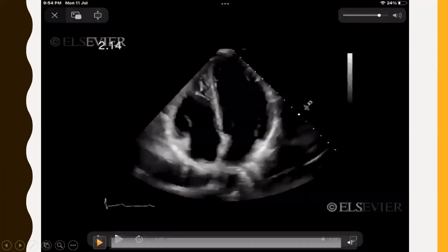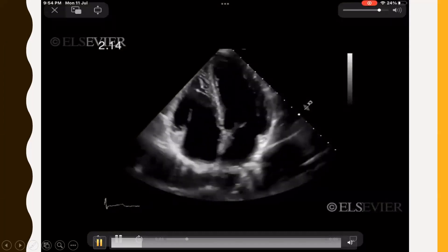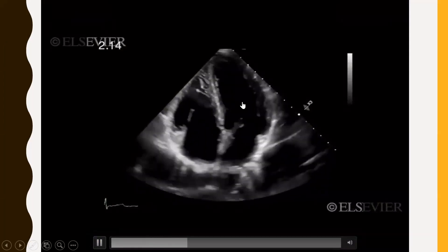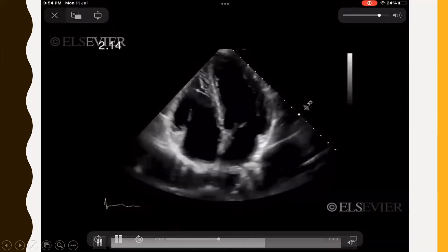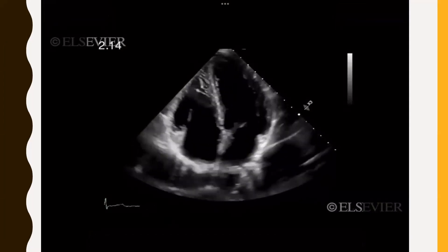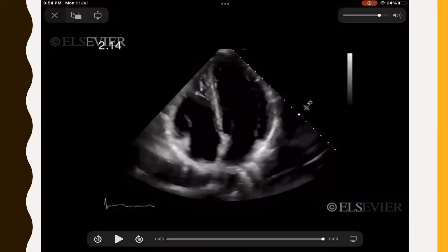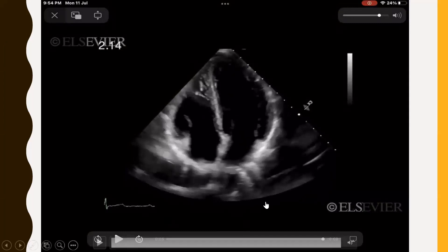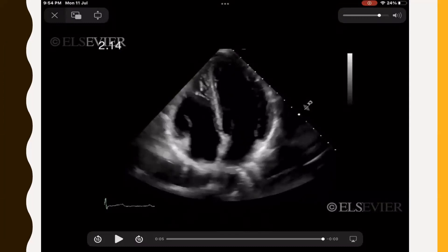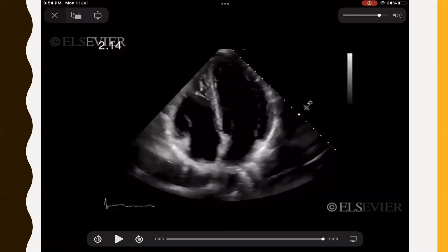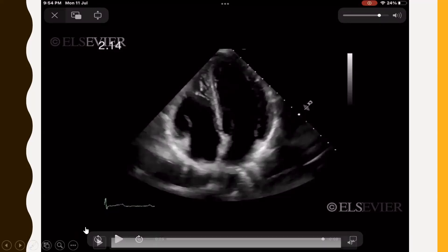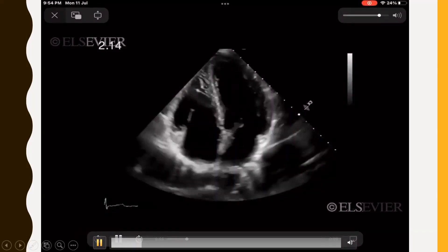The apical four-chamber view video shows LA, LV, RA, and RV. We can subjectively observe good contractility with walls moving freely. While measurement criteria exist for ejection fraction and valvular assessment, grossly from this view the walls appear to move freely and contractility is good.